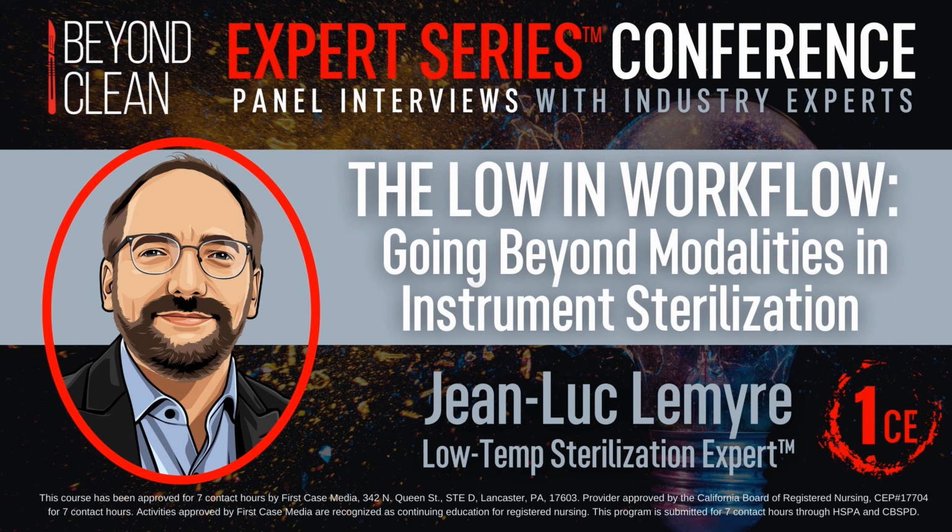So I think during the design, we think about it from the end user and the SPD, but also the patient. So if I start with the end user, the sterilizer has got to be leak tight. We don't want any leak of sterilant going into the room. We have to make sure that the catalyst works properly and can handle a lot of sterilant, again to make sure there's no peroxide going into the room. So the catalyst does a good job. It's a well-known technology to destroy peroxide into water, vapor, and oxygen.